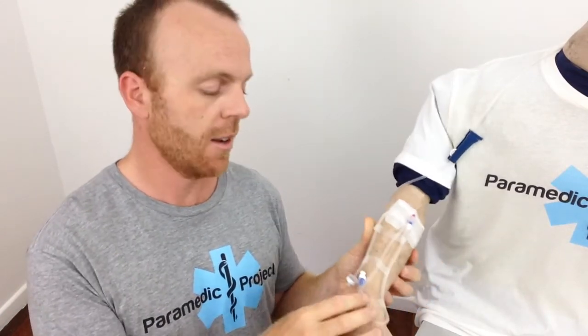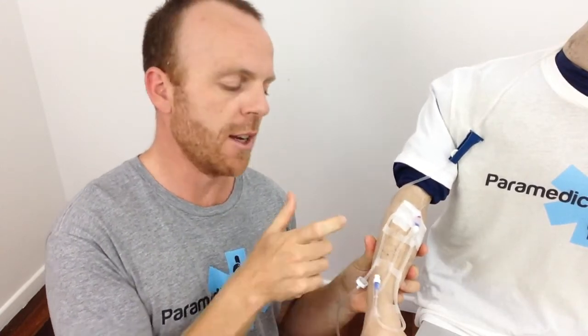Which is really important — it's a patient's lifeline where we can administer drugs and fluids if required. So first of all, we've got some slack. Second of all, we've still got access to the actual port on the IV fluid line, which means we can administer some drugs down that port. So that's really important.